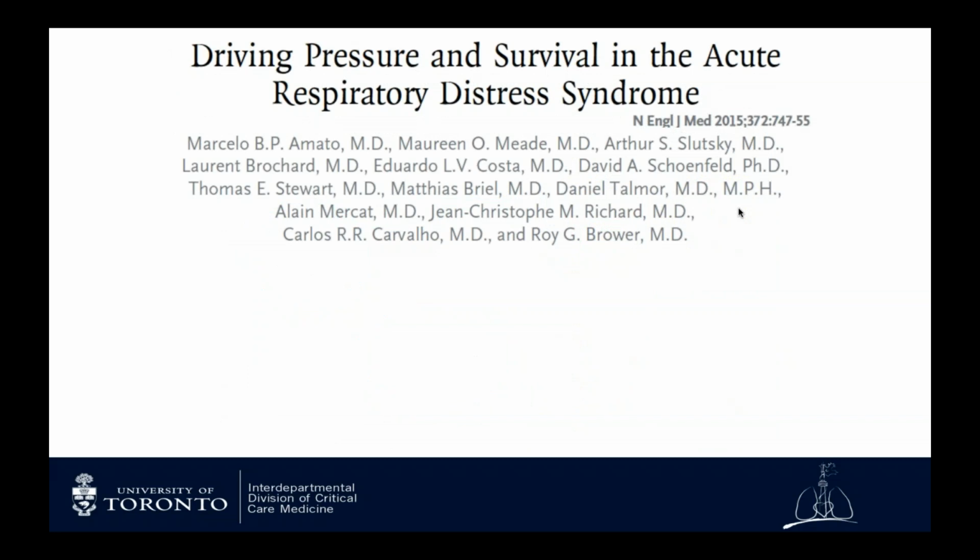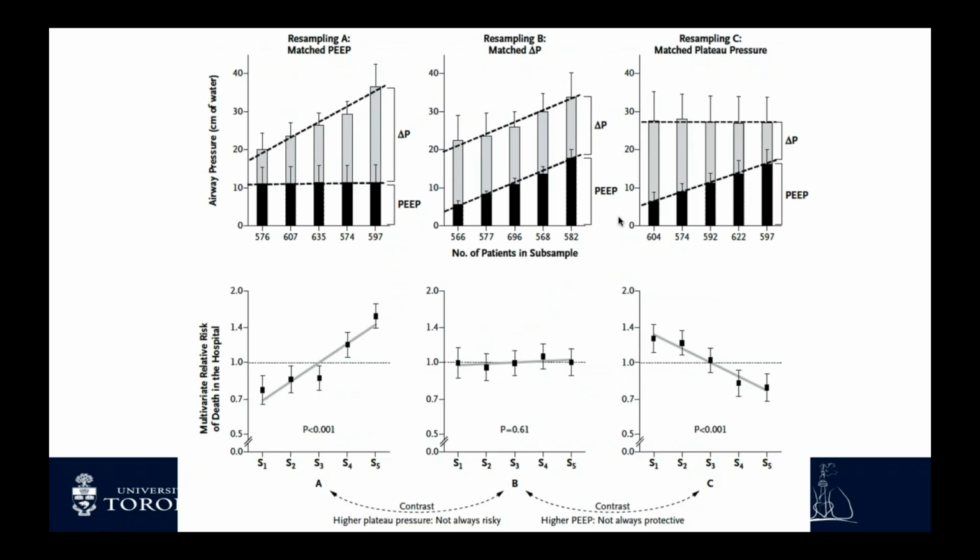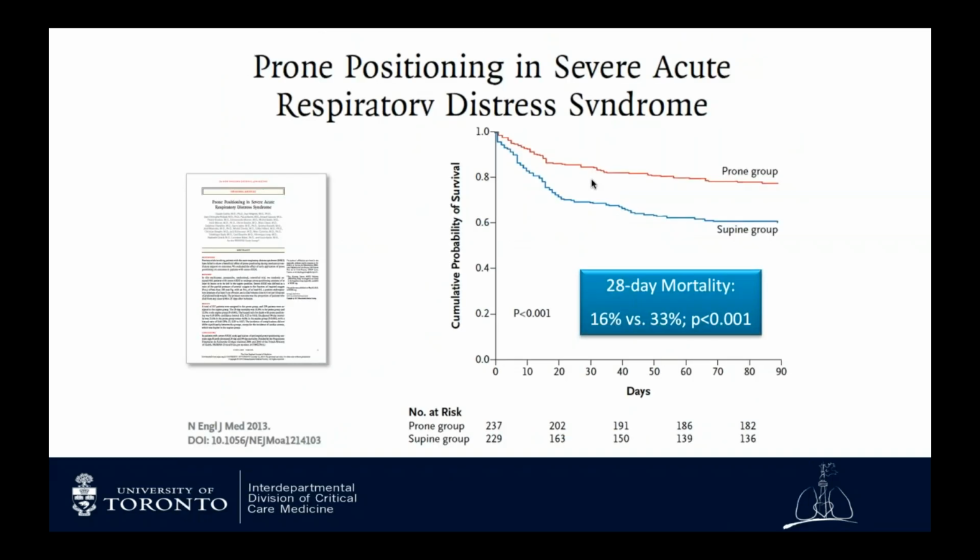And this helps us understand the concept of driving pressure. So we know that taking care of tidal volume is important, but if you look at the driving pressure, which is the distending pressure across the respiratory system, so the plateau pressure minus PEEP, there's a clear association with mortality that is independent of PEEP here. So fundamentals here are so far taking care of tidal volume, focusing on driving pressure and trying to keep it less than 15.